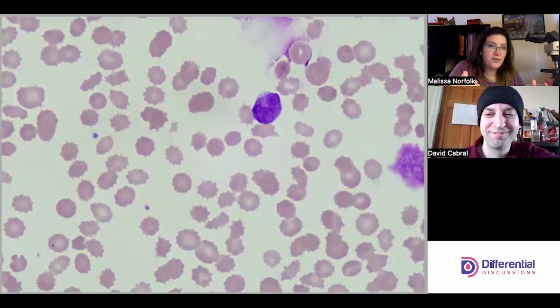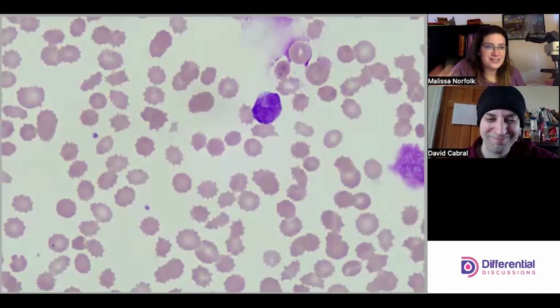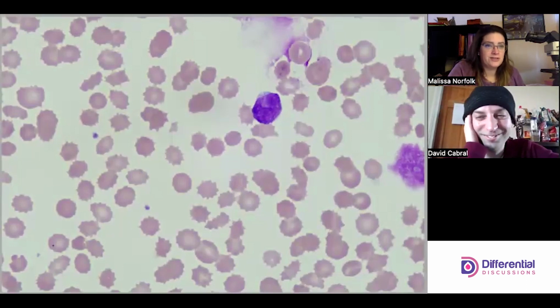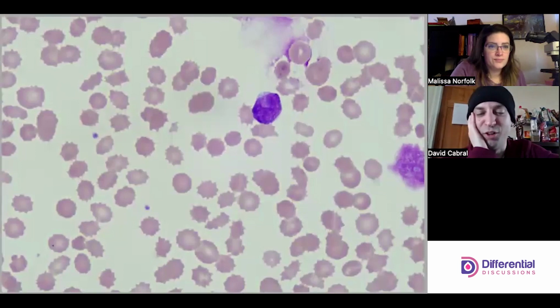And then you're going to know there's X% of these cells. So hemming and hawing over a cell, if you're within the variability of your count, say flow tells you there's 35% and you're at 37, no one's going to care. Virtually identical numbers.